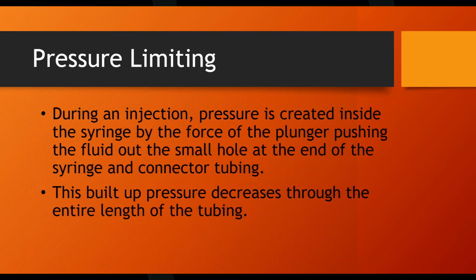Again, the volume is how much fluid we're gonna fire into the patient. The flow rate is the speed at which we'll fire that fluid into the patient. And then the pressure limit is the maximum pressure that we will allow to build up in the syringe during the actual injection. I'll go into great detail about that. Actually, I'm going to talk about it right now. My bad.